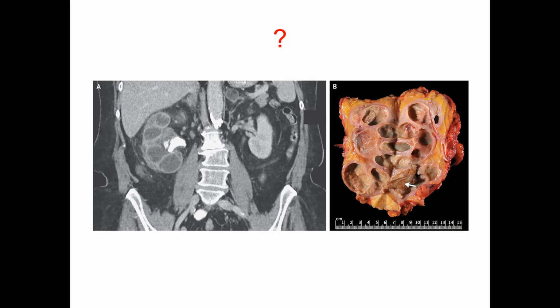Yeah. How do you differentiate xanthogranulomatous kidney from tumor? Tumor would enhance. Xanthogranulomatous kidney is a non-functional kidney. It will not enhance. Okay. So this is a kidney again, xanthogranulomatous. It is not enhancing. See, it's not enhancing.